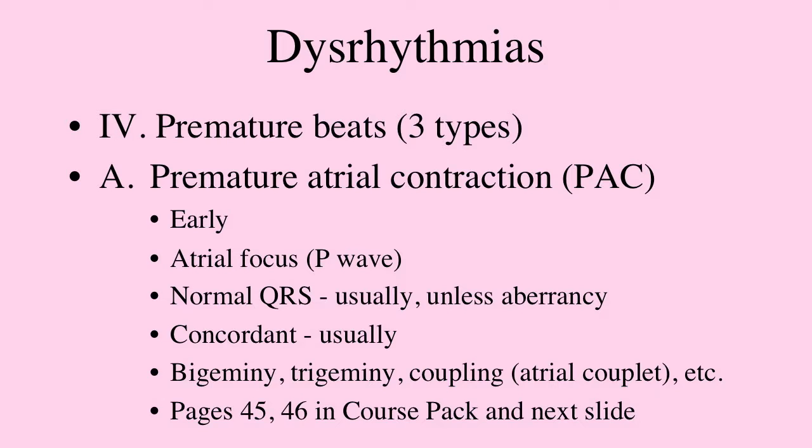It's early. There's an atrial focus with a P wave. There's usually a normal QRS complex, and usually concordant. Concordant means the PAC QRS complex usually goes in the same direction as the beats before it and the beats after it.